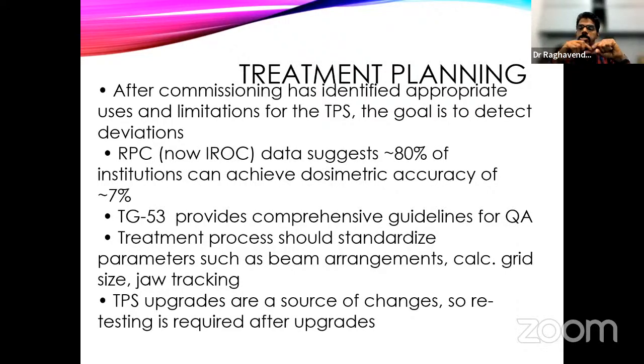We know the composition of the target. We know how many interactions happen and how many electrons get converted into X-rays. Once it's converted, how they travel towards the patient. So when we have this model, the Monte Carlo system should have precise information about the linear accelerator compositions. It needs to have the target compositions, the exact distance, thickness, everything available with that particular model, and using that we start the transport problem and we get the derived dose at the center.